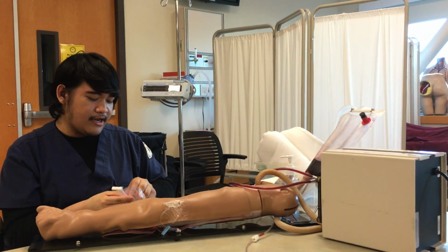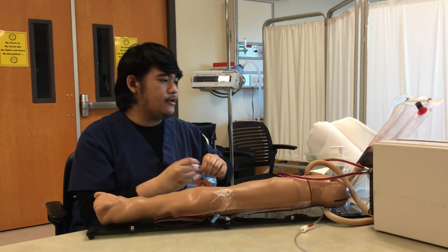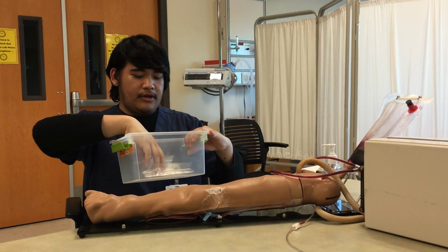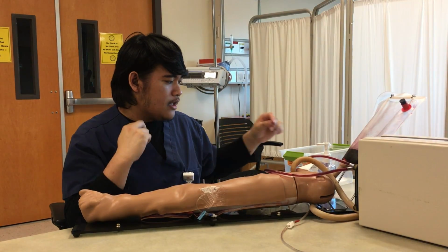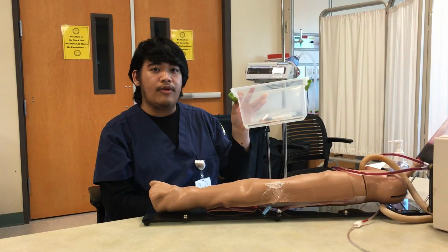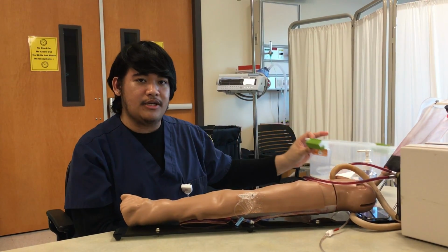If I can't run this within 15 minutes, I would put this on the ice slush to prevent any clotting or things like that. And then I need to make sure that I run this within the hour, because if not, then I have to take another blood sample from the patient.